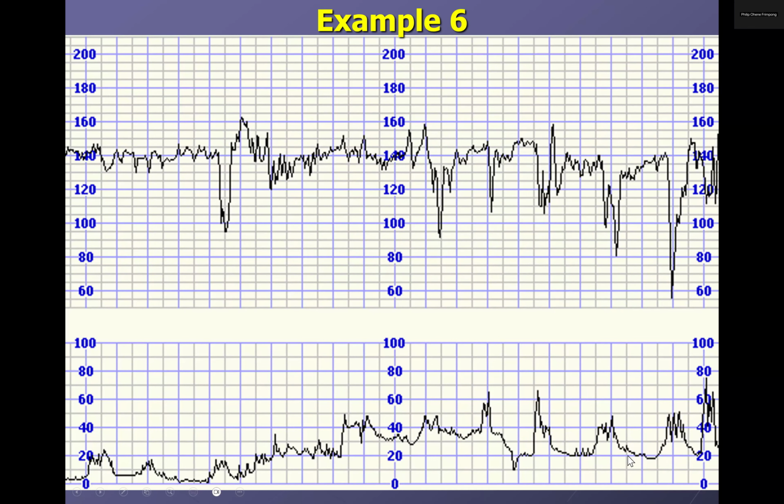From the chart here, I would say 5. Yes, 5 contractions in 10 minutes. 1, 2, 3, 4, 5. Yes, very good. Here, probably there was loss of contact, because she's obese. But here you can easily count 5, which is fine. So this is your contractions.